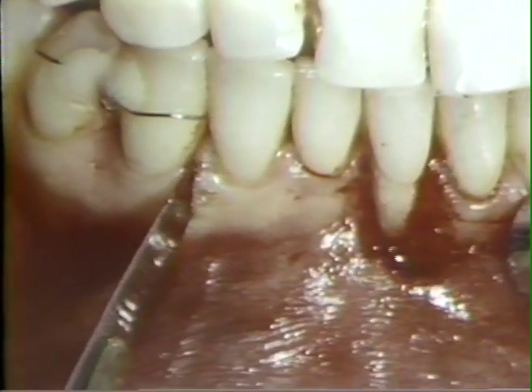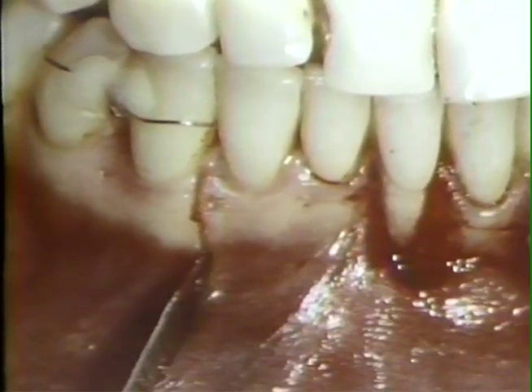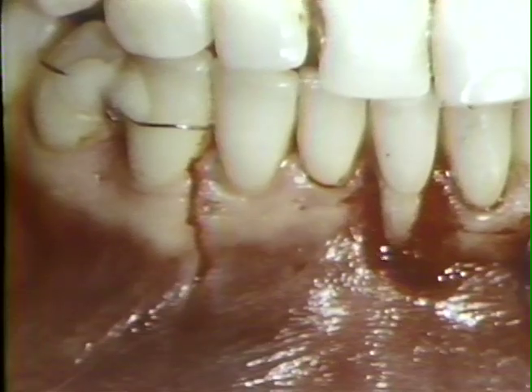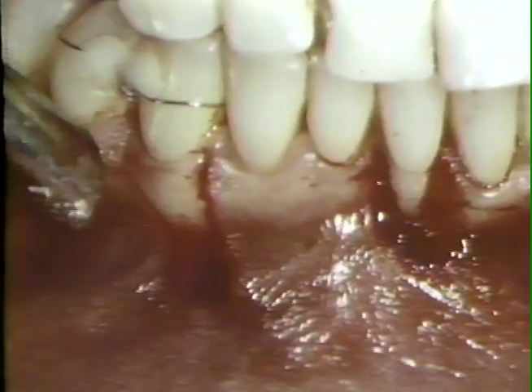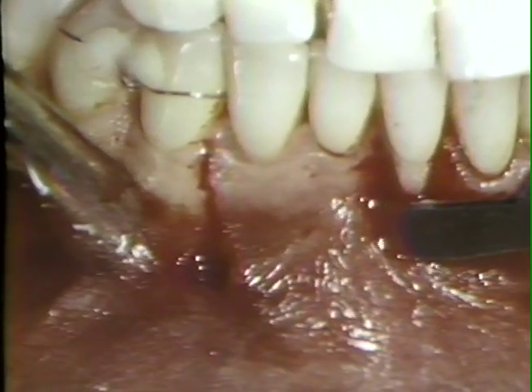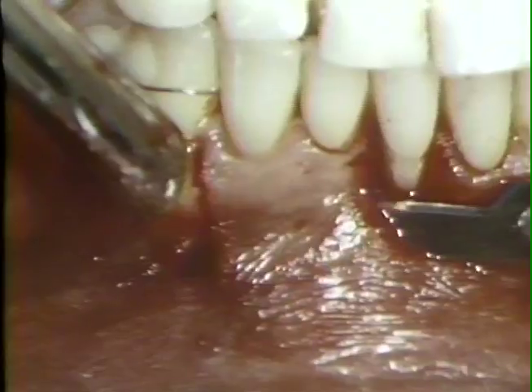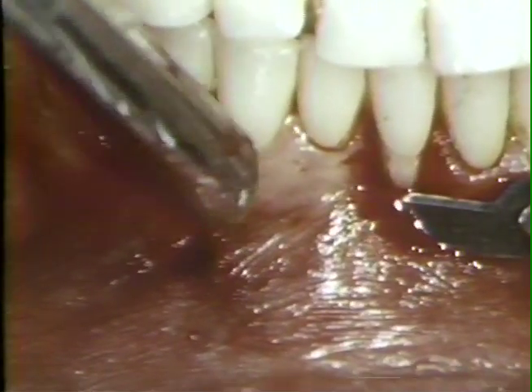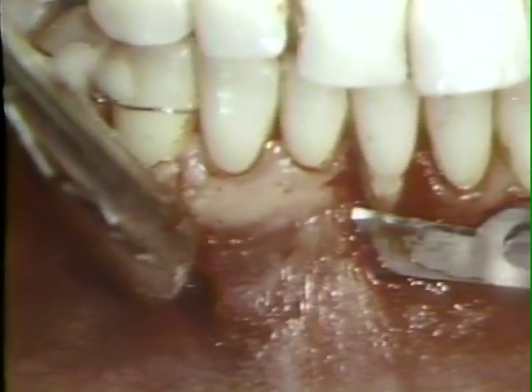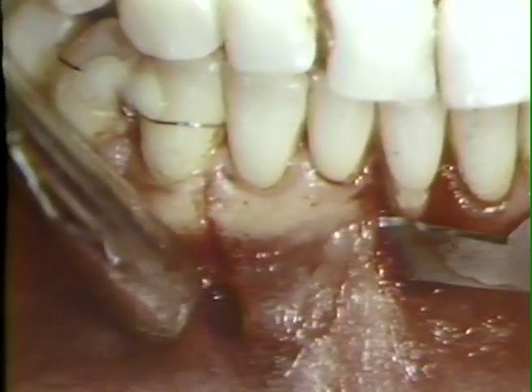A vertical releasing incision is made at the distal end of the donor flap from the margin into the mucosa. The scalpel blade is slipped under the mucosa and a sharp partial thickness dissection is carried toward the gingival margin. The use of a partial thickness or a split thickness flap enables the clinician to leave periosteum on the donor site, which does not denude the underlying alveolar process.